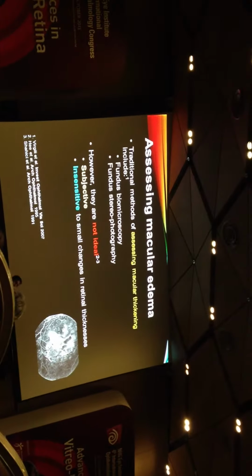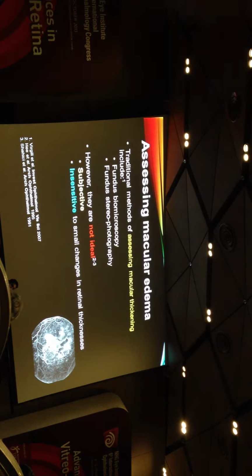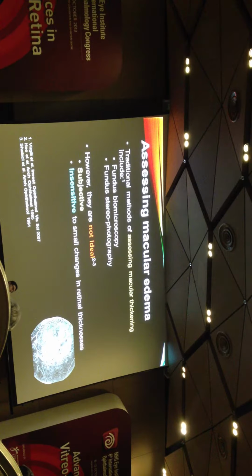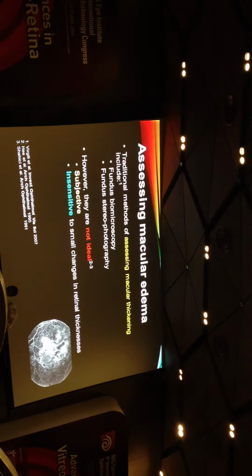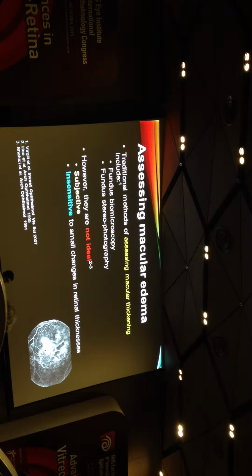So when we assess macular edema, traditionally how do we do it? Obviously we've used clinical examination, we've used stereophotography, but these, whilst they serve their purpose and it's obviously an important skill to have, are not ideal because they can be subjective, when what one person sees, another may not, and it's also insensitive to small changes in retinal thickening.